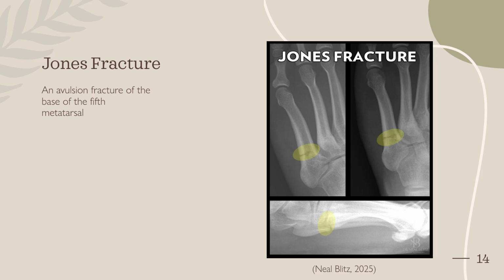Pathology that we can see with our lateral and oblique projection is the Jones fracture, which is a fracture of the base of the fifth metatarsal, as we can see here in the lateral and then here on the obliques.